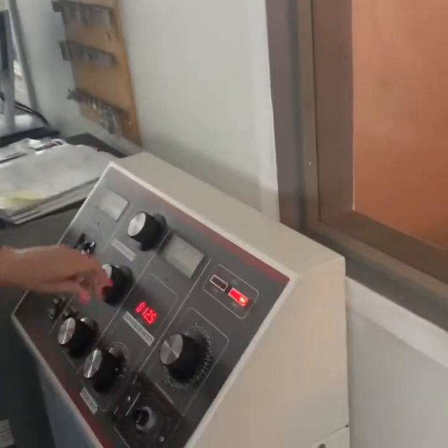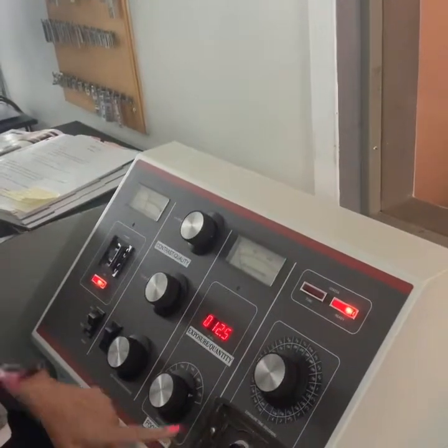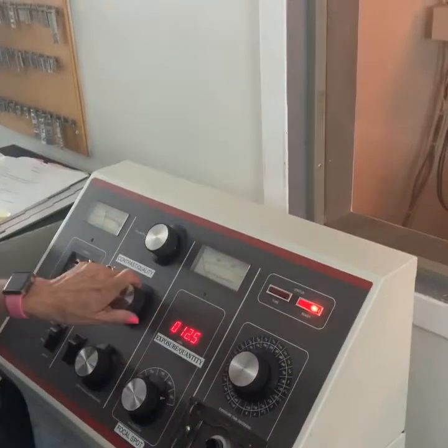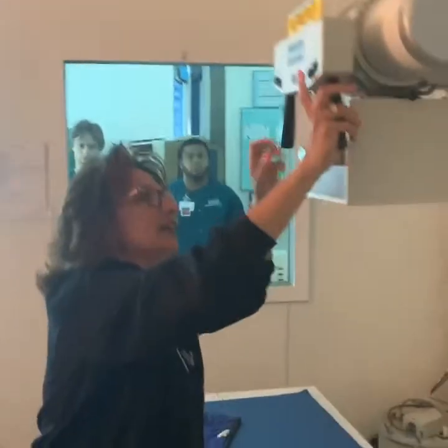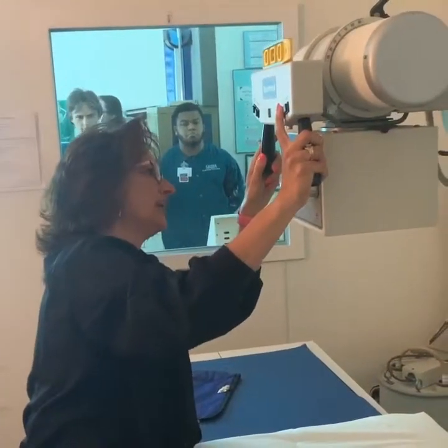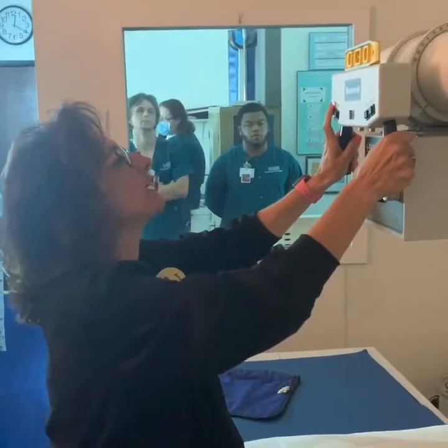We are gonna set 80 at 12.5, and since we're in the bucky, ideally we want large focal spot. So I've got it on 300 at 1/24 of a second, gives me 12.5. 80 kVp on that. On the femur, there's 4 views to a femur. There are 2 APs and 2 lateral. Because femur is a long bone, we have to get both joints with that. So what we end up doing is a proximal AP, a distal AP, a proximal lateral, and a distal lateral.